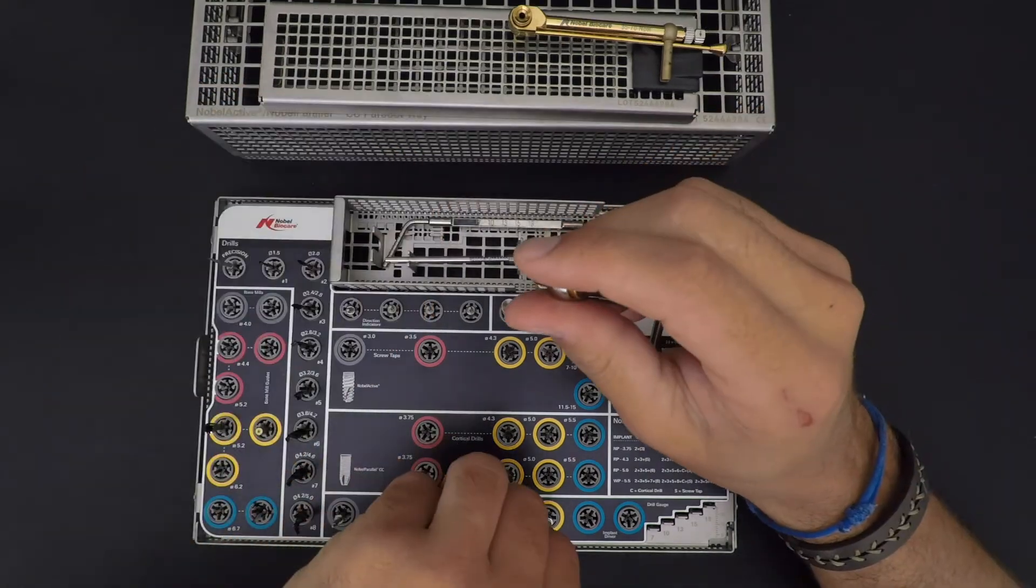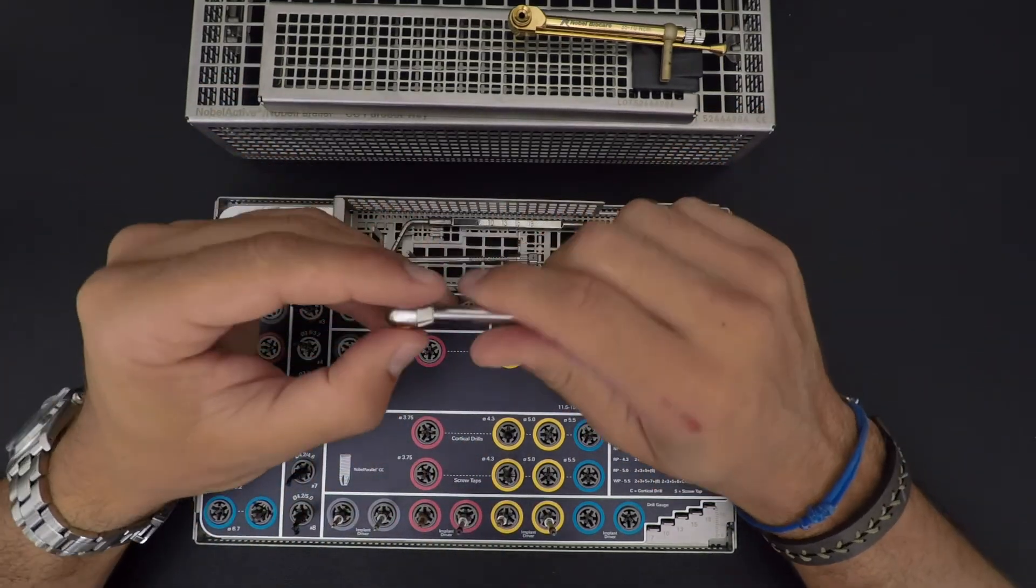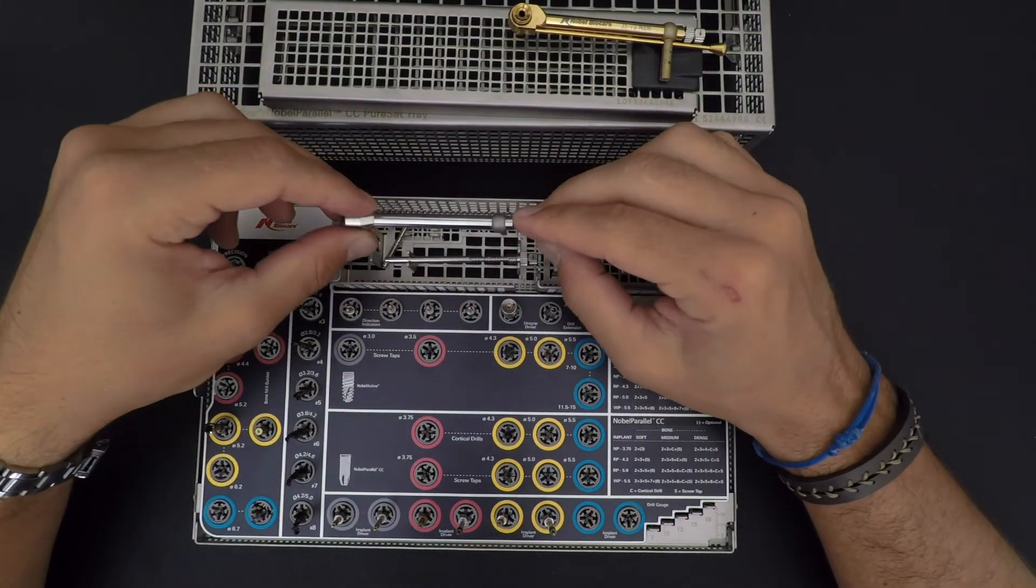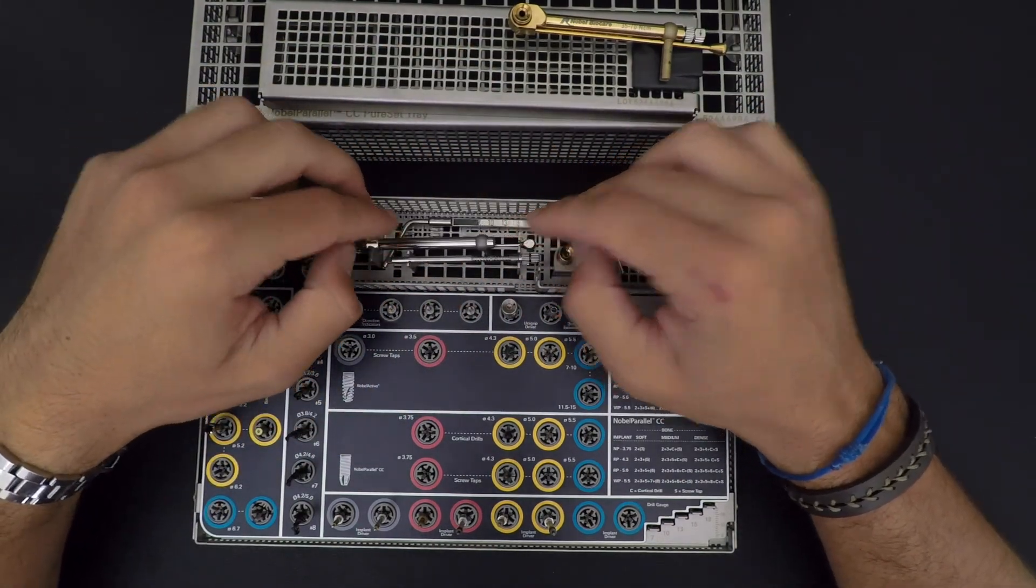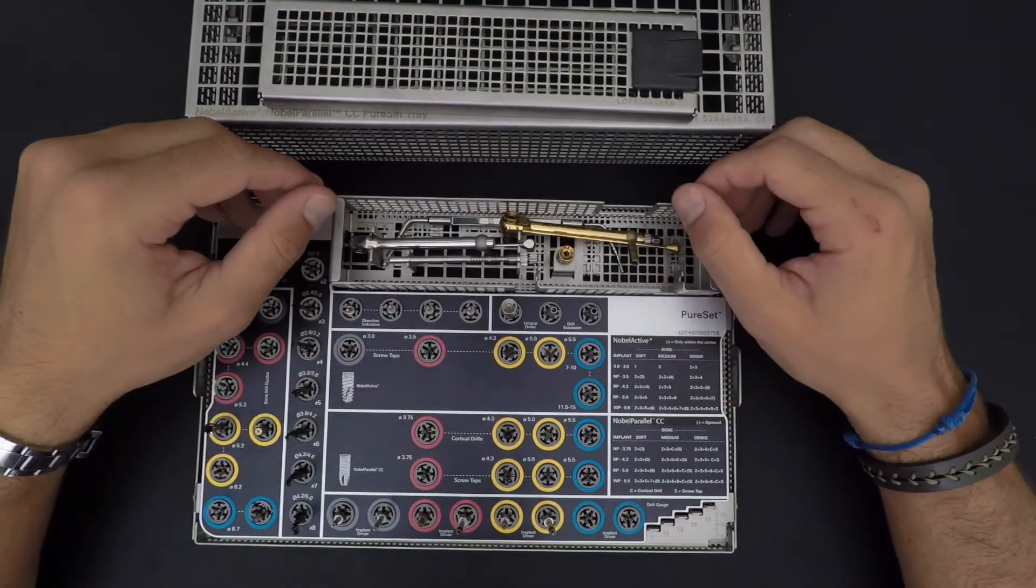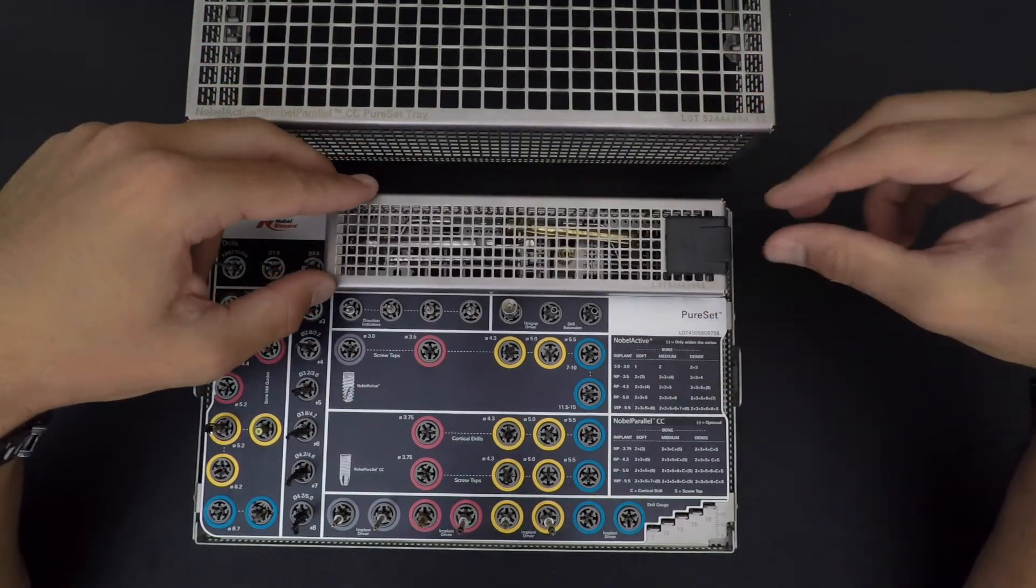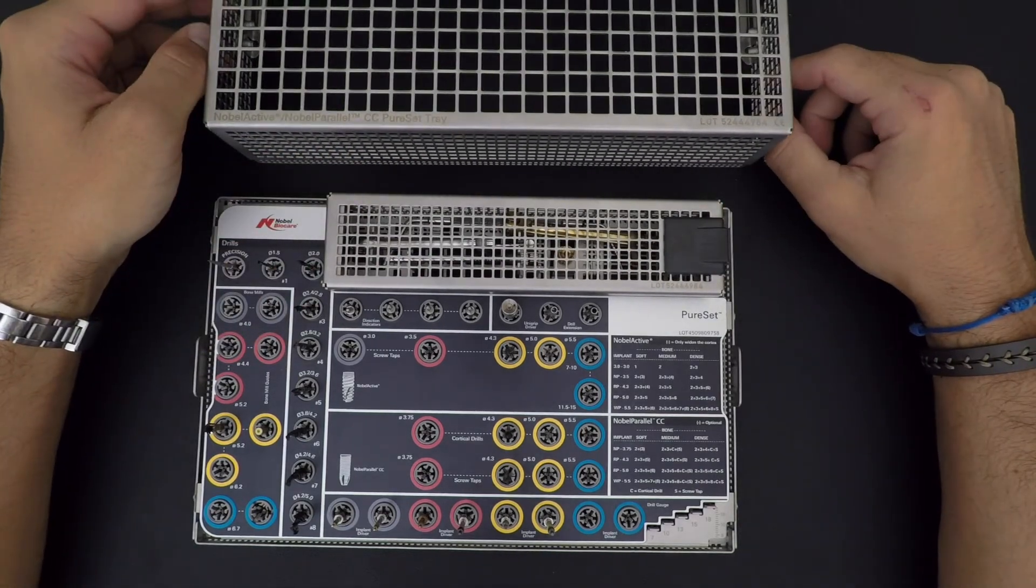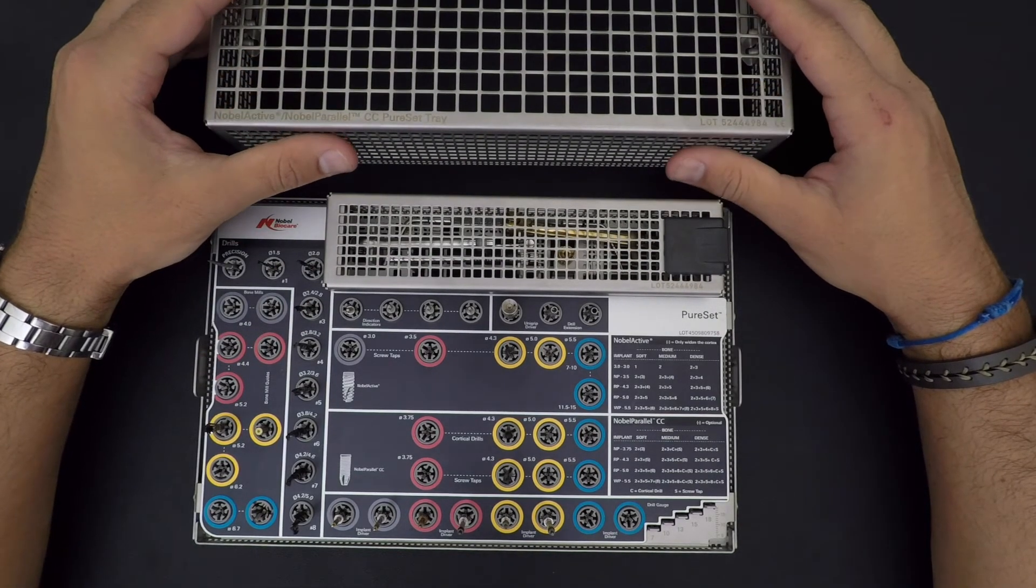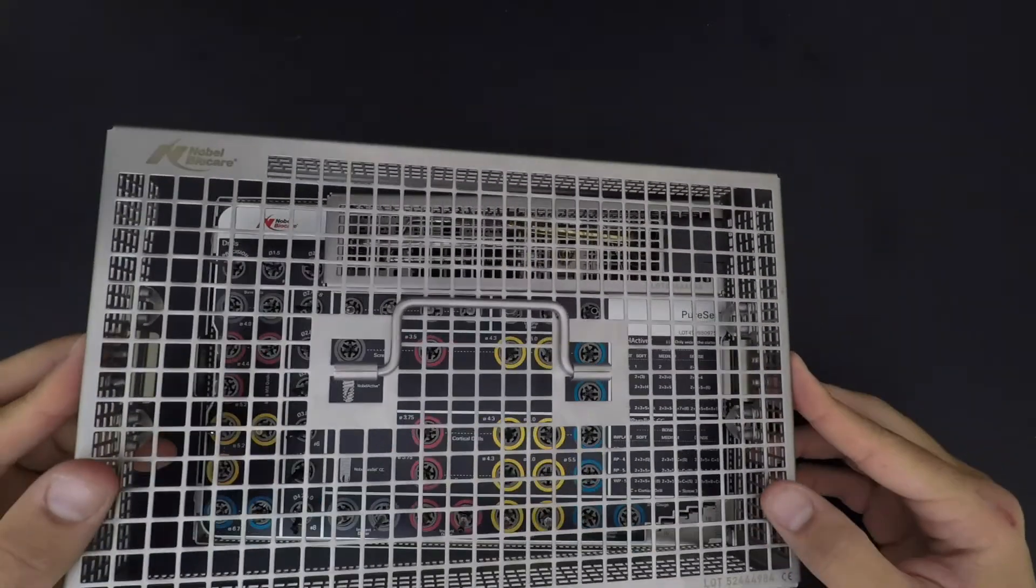All of the Pure Sets always come with some fact sheets that show you how to put the components in the tray and how to clean it. It's always good to keep this in your sterilization room so you can always have a look at it. Once you've done your surgery, you want to clean, brush everything, close your Pure Set.